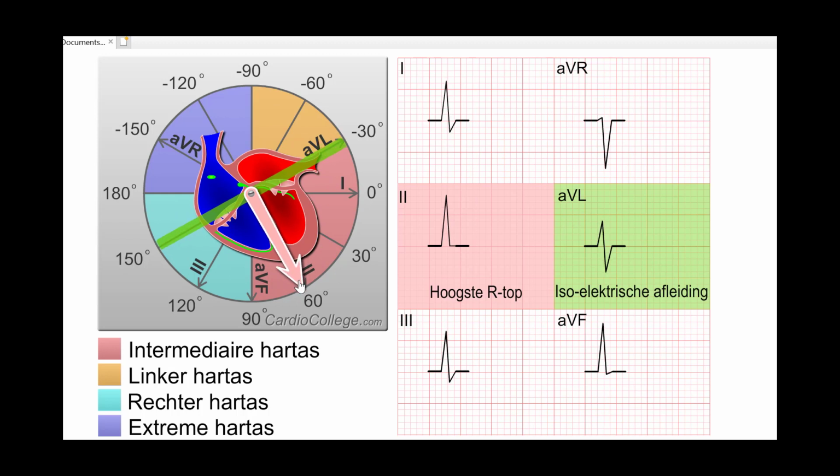Now we're only showing the QRS signals here on this little chart, but you can see lead 1, lead 2, AVR, AVL, and AVF. Now lead 2 has a very strong signal, which we'd expect if the heart's depolarization is moving at our lead. We look at AVR, which is the opposite, right? AVR looks up and to the right, and we see a negative mirror image because the patient's heart is depolarizing away from AVR. We can also see something interesting if we look at AVL.